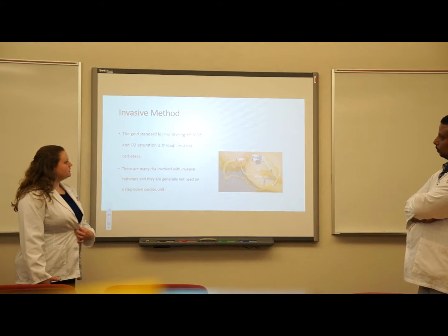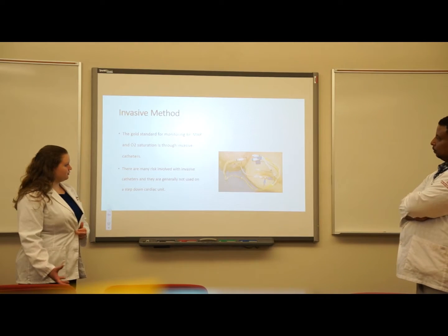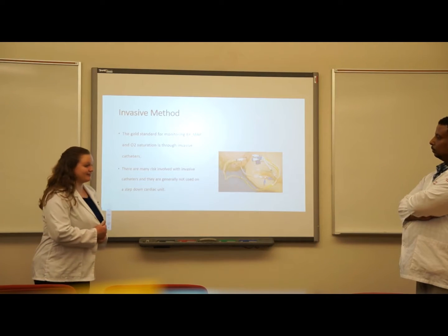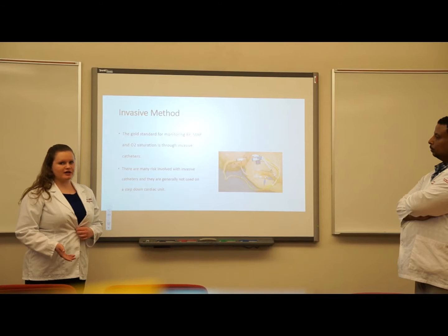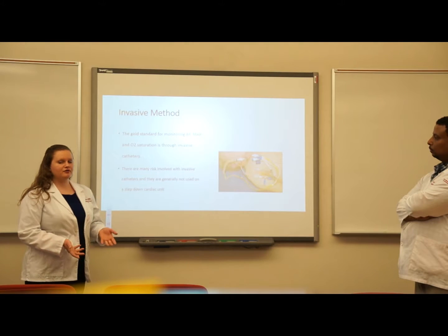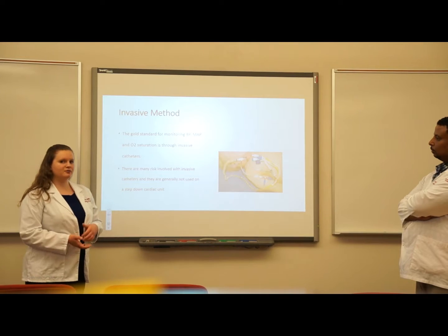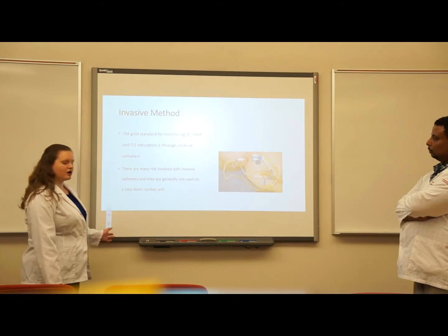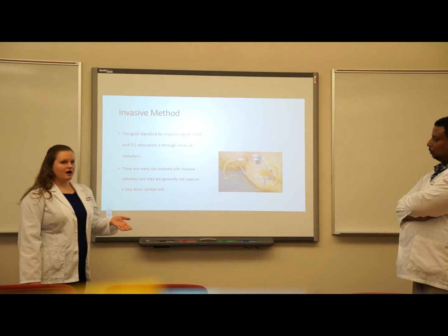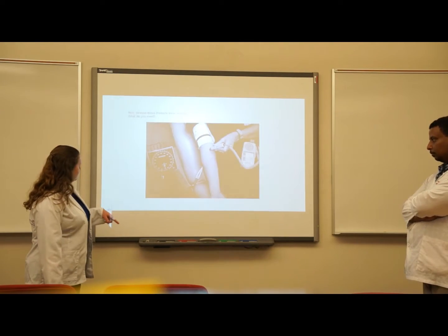The gold standard for measuring O2, MAP, and BP is through invasive measures. However, on a step-down unit, the catheters used can present a lot of complications and are high risk for infection. So on a step-down unit, we try to hemodynamically monitor in a non-invasive way.